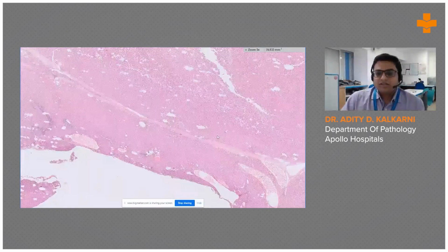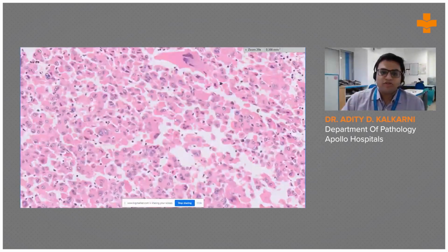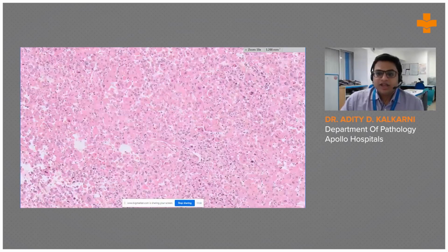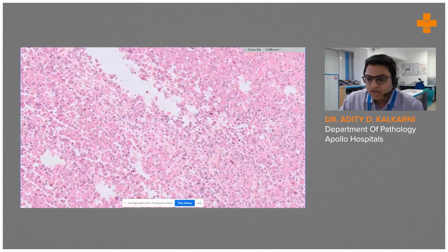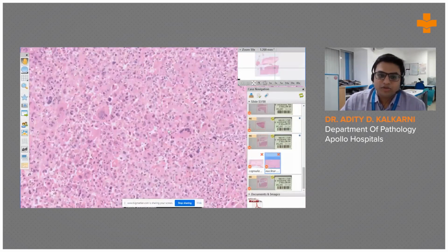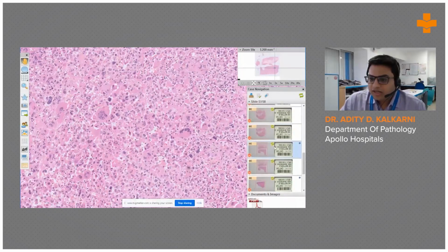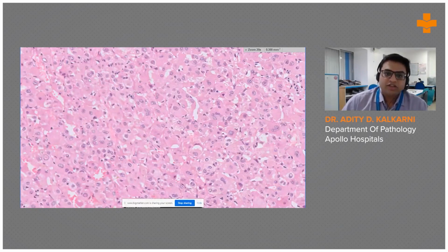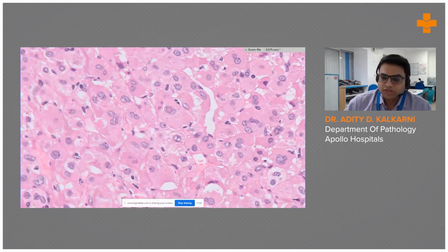The nuclei showed a lot of pleomorphism, as you can see here. I'm panning in the same section, and you can see there is considerable nuclear pleomorphism here. You are seeing bizarre forms, you are seeing multinucleated forms, and there are nuclear pseudoinclusions, again another focus showing the pleomorphism, and there are pseudoinclusions in most of these nuclei, which are again a sign of the nuclear membrane irregularities. As you can see here, the pseudoinclusions.